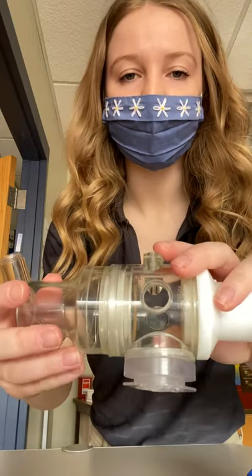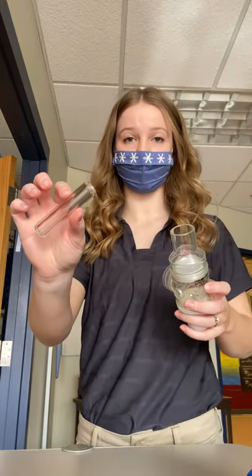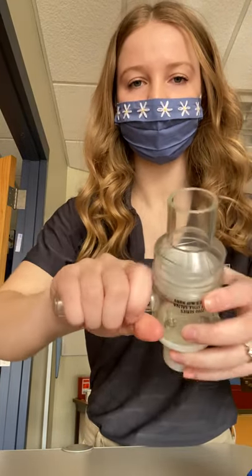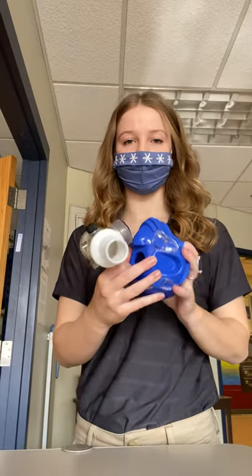There's a hole on the bottom of the center valve where the spit valve goes, so you'll just screw that in there. And then you have the chamber all assembled, and now you just need to connect it to the mask itself.